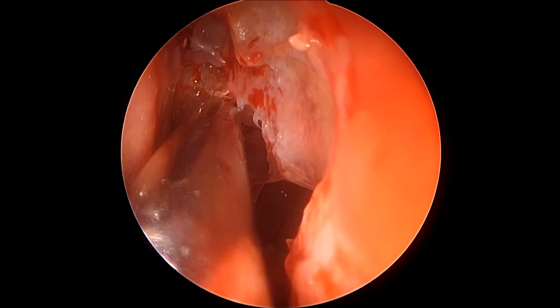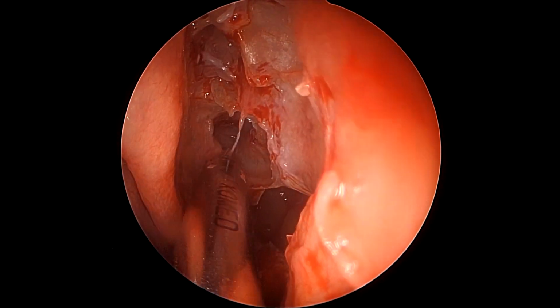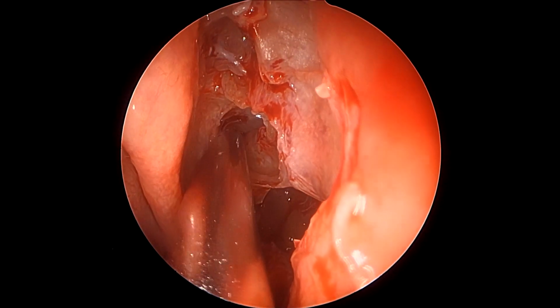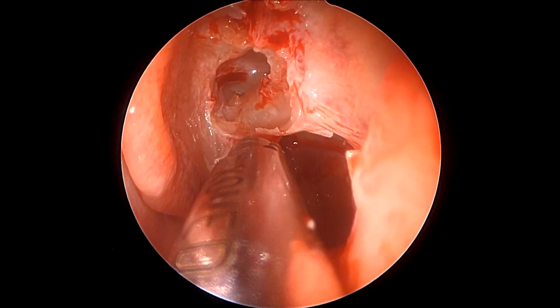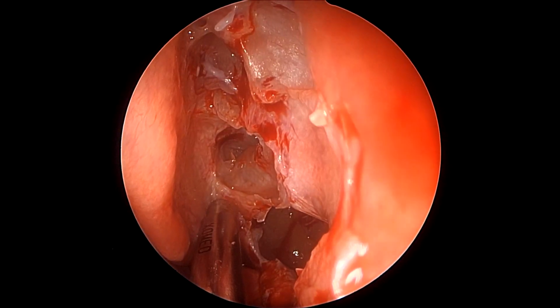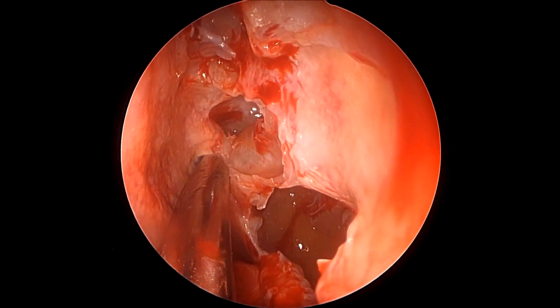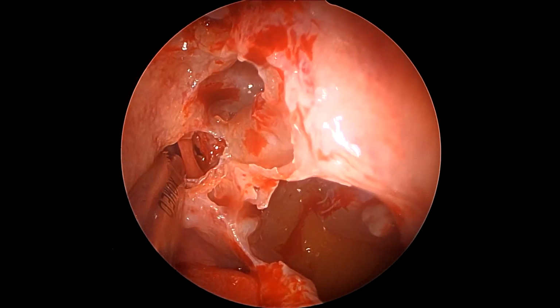This is the basal lamella being opened inferiorly. Once again, it can be seen how the initial opening is done at the level of the horizontal antrostomy ridge, or the superior wall of the maxillary antrum, also corresponding to the medial orbital floor. And that seems to be the right place because that guides us straight towards the sphenoid sinus, which is also the lowest point of the anterior skull base. Once we have located the lowest point, we can obviously proceed anteriorly.